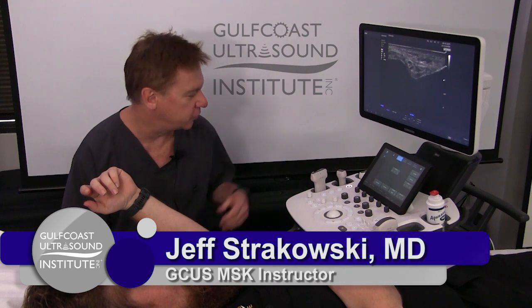Hi, I'm Jeff Strakowski. I'm here at Gulf Coast Ultrasound with Casey, and we're going to show you the dynamic assessment of the ulnar nerve at the elbow.